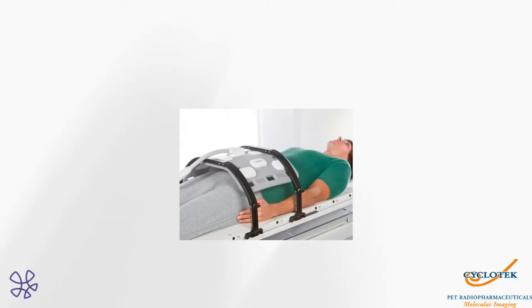Big donut. We always use big donuts now. Radiology is about big donuts. So there's the donut hiding in the background. We've tried to make it less scary by blurring it into the background. But it's a big tube. So those who are claustrophobic, tell the MRT who's doing the procedure you're claustrophobic, because you're in there for a while, and they'll give you some meds to make you feel happy.